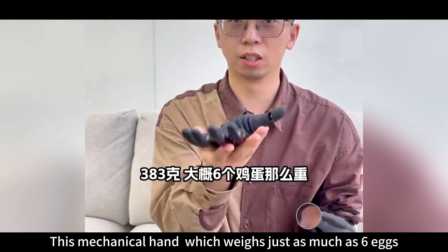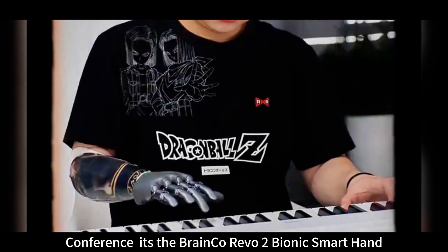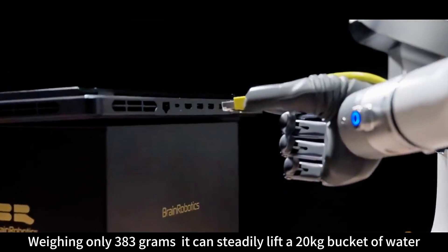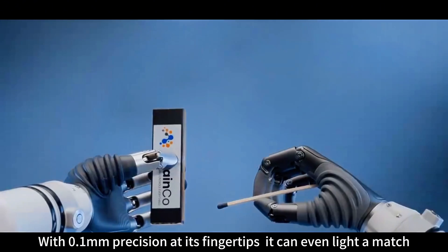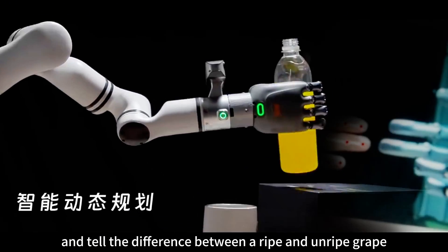This mechanical hand, which weighs just as much as six eggs, wowed everyone at the World Artificial Intelligence Conference. It's the Brinko Revo 2 bionic smart hand. Weighing only 383 grams, it can steadily lift a 20-kilogram bucket of water. With 0.1-millimeter precision at its fingertips, it can even light a match and tell the difference between a ripe and unripe grape.